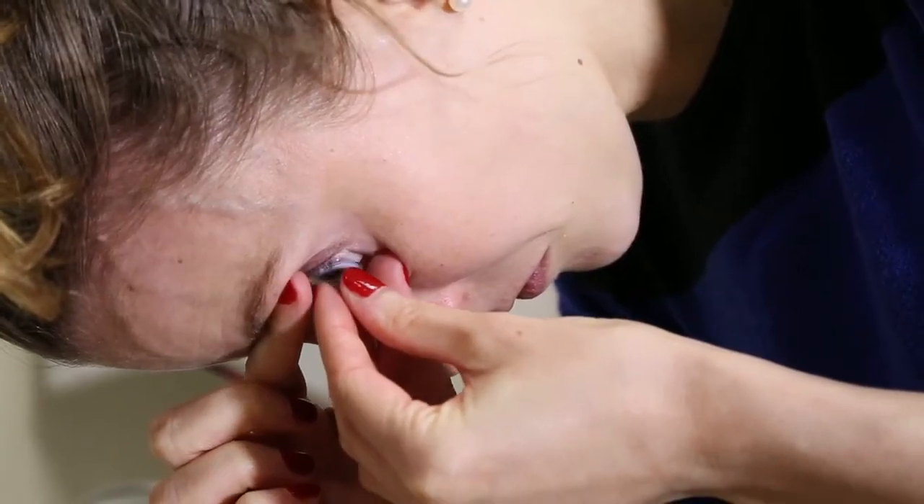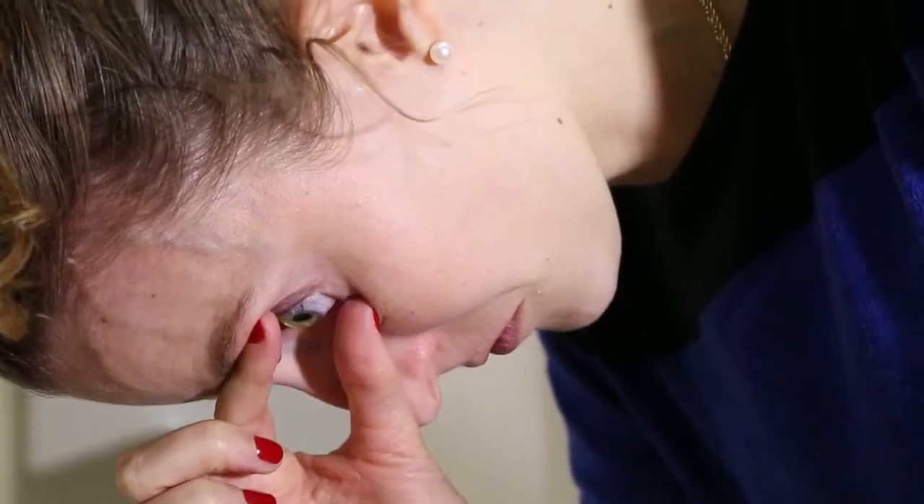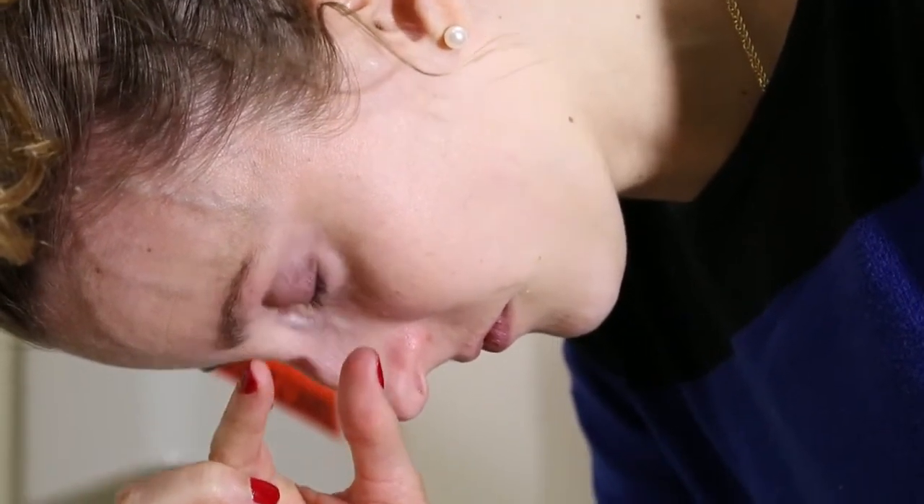Bring the other hand with the lens up to the eye. You will feel the solution touching the eye, and then you will feel the lens gently on the eye. Bring your fingers away from the face and then release the eyelids.